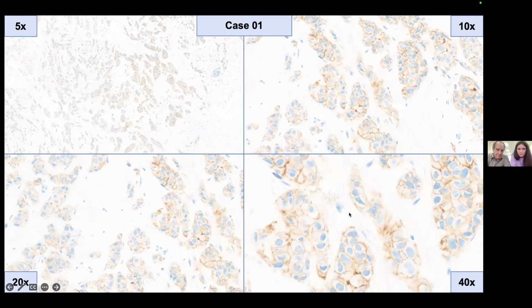Fantastic. Okay, we can share results. These are the results. So the greatest majority thought this was HER2 low, but there is a sizable amount that say this is indeterminate, HER2 2+ indeterminate. Okay, let's stop sharing. Adelina, tell me what you think.